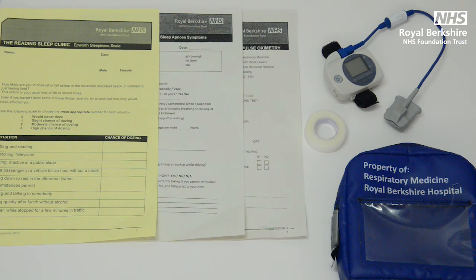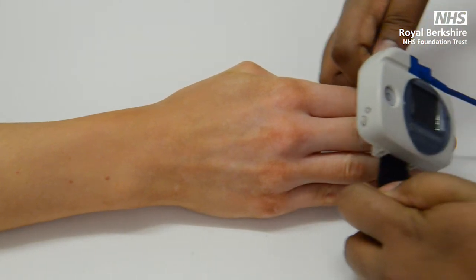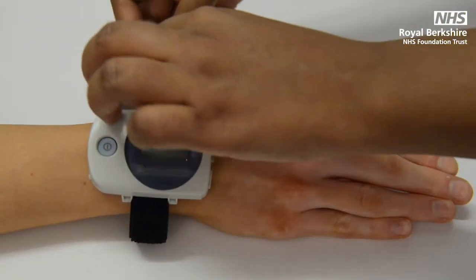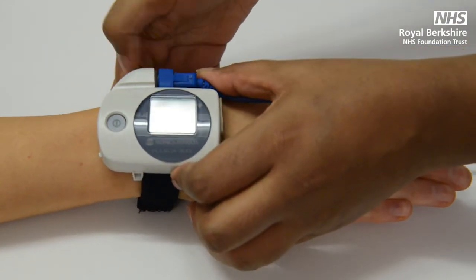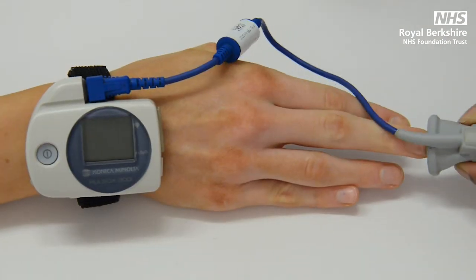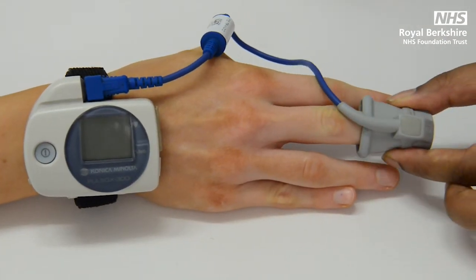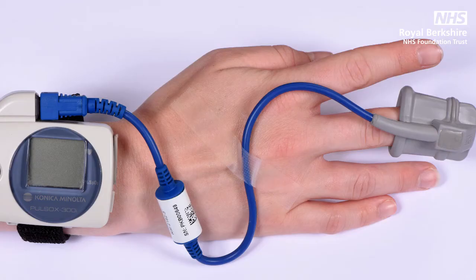To complete the overnight sleep study, you will either be given one of two machines to wear overnight. Inside the blue case you will find the machine and a roll of medical tape. To use this particular machine, place the wrist strap around your wrist on your non-dominant hand, securing with the velcro strap. Place the finger probe on your middle finger, making sure that the blue wire is going over the top of your hand. Secure the blue wire down with the tape provided in the case.